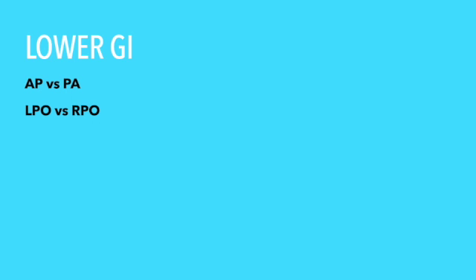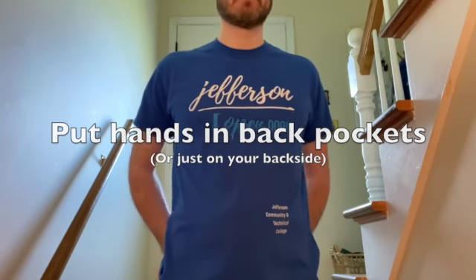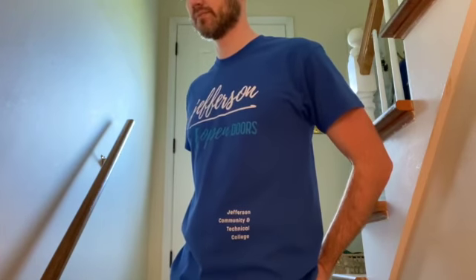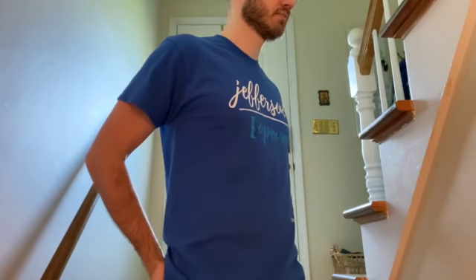You can use a similar trick to tell where the contrast will be in a lower GI, and also to tell what anatomy you'll see during the oblique projections. If you put your hands in your back pockets, you can tell which oblique will show what. In an RPO, you'll see the left colic flexure and descending colon, and in an LPO, you'll see the right colic flexure and the ascending colon.